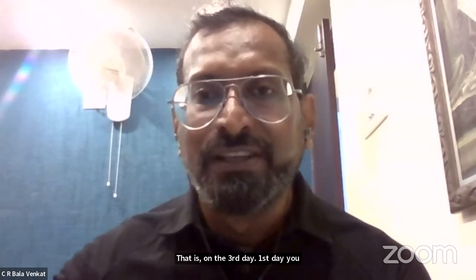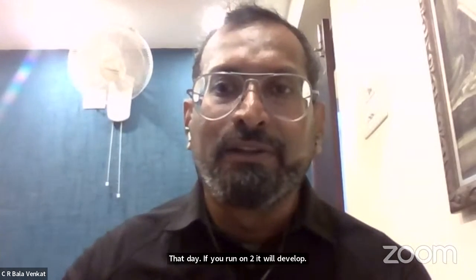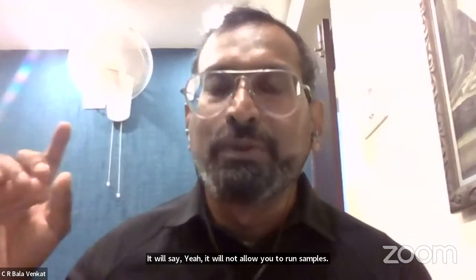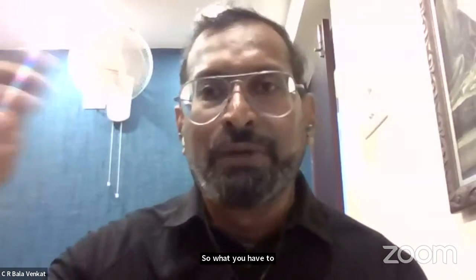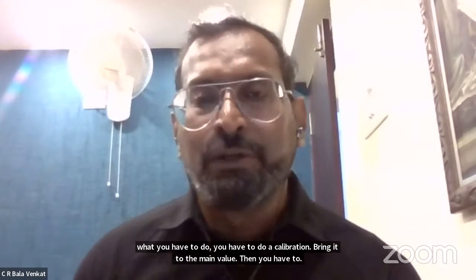Second day on 2 SD. Third day, if you run on 2 SD, it will give an alert. It will not allow you to run samples if you trigger the Westgard rule. So what you have to do is a calibration, bring it to the mean value, then you can start running the samples. Otherwise, it will not allow.